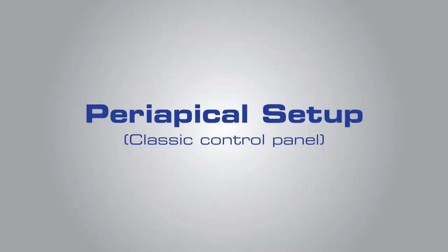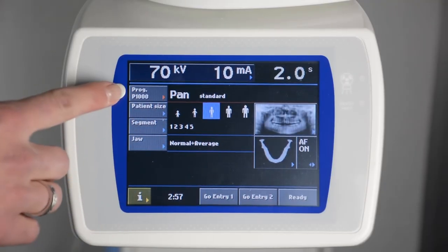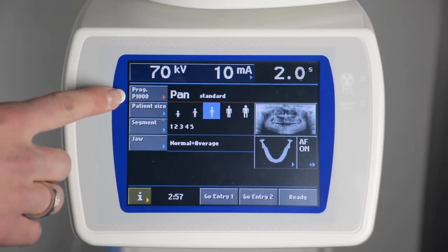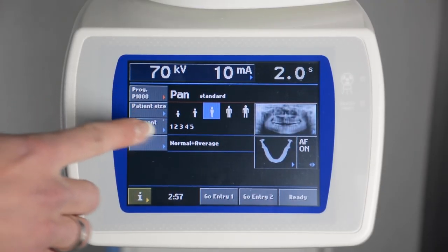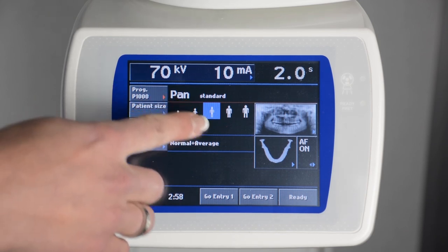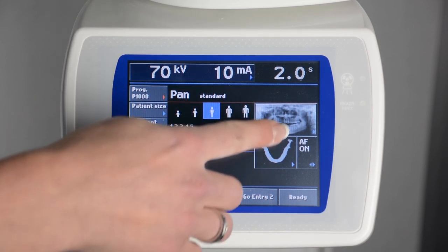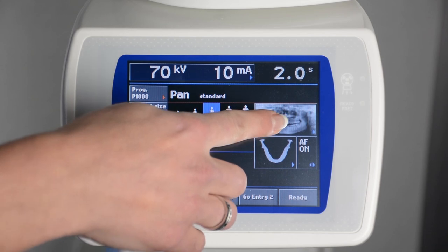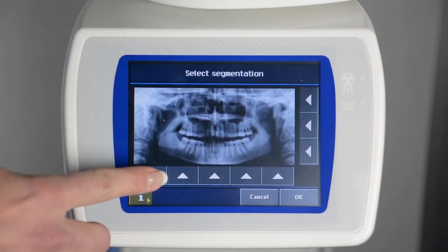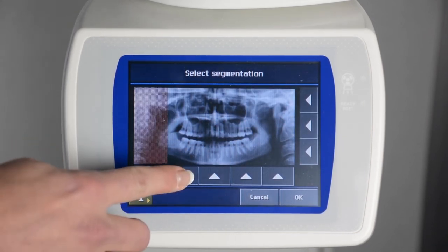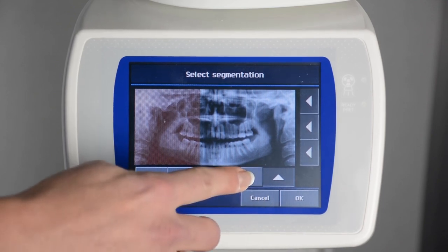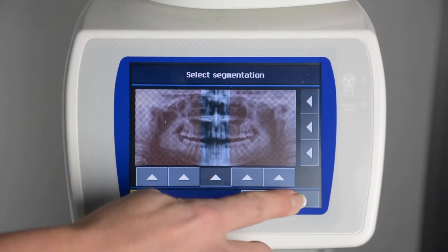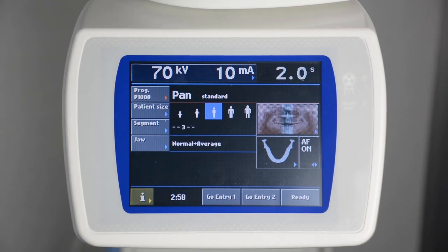To capture a segmented PA-like view, select Standard Panoramic and choose the patient size and appropriate jaw shape and size as you would for a regular panoramic image. Press Segment or the panoramic image on the touchpad. Using the arrows, isolate the desired region of interest, then follow the Standard Panoramic positioning instructions.